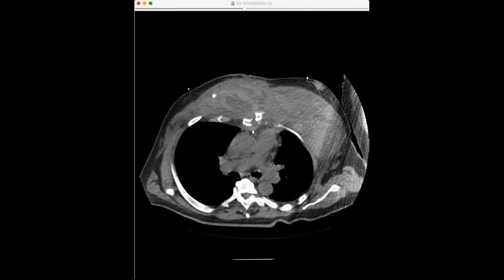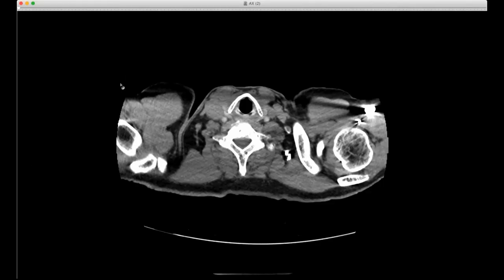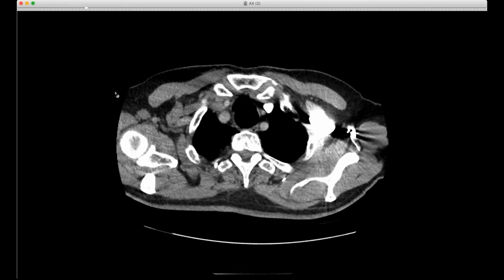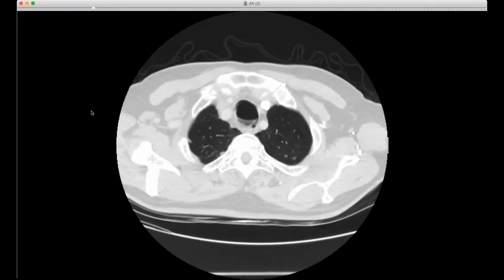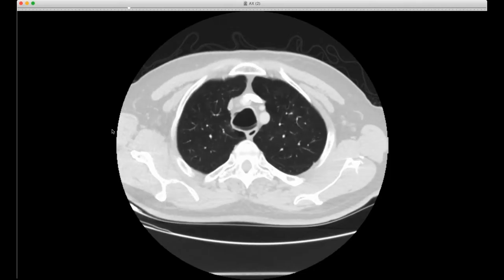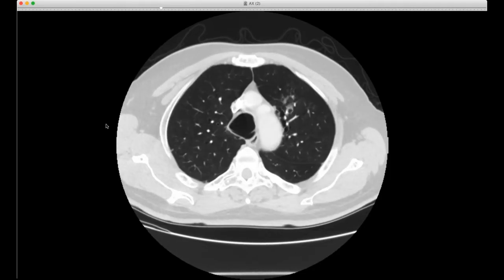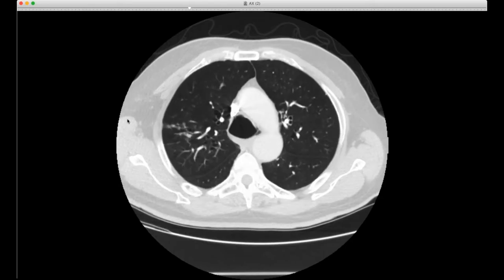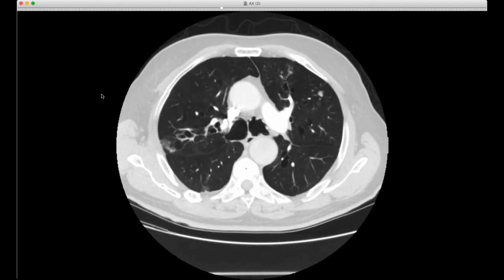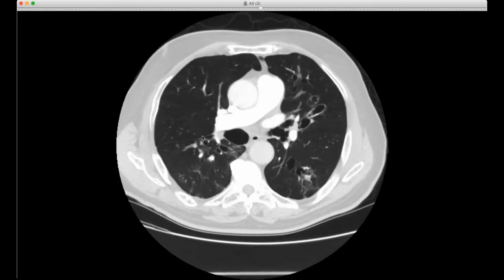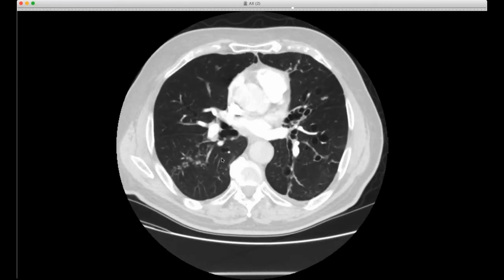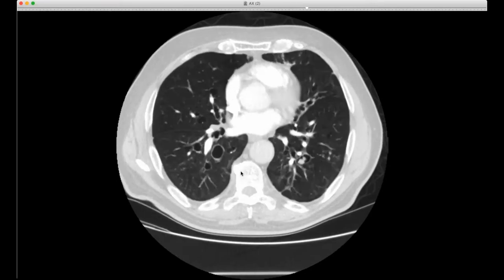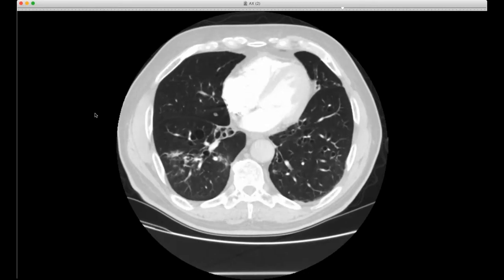Here's another case — it's just a coincidence that I have this loaded up. This is an 80-year-old patient, and the most interesting thing about this case is actually the symptomatology — none, or very little. You can see there is tracheomegaly and bronchomegaly; multiple orders of bronchi are involved. Additionally, you have some higher-order bronchi involved than you'd otherwise think of in Mounier-Kuhn. Just very distended, irregular bronchi and trachea.